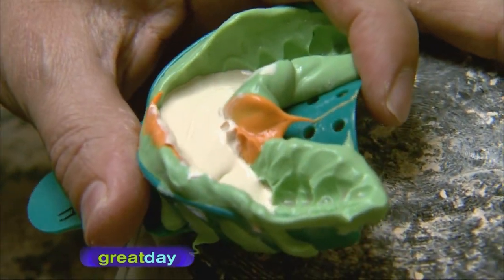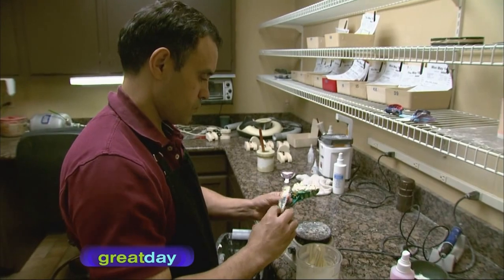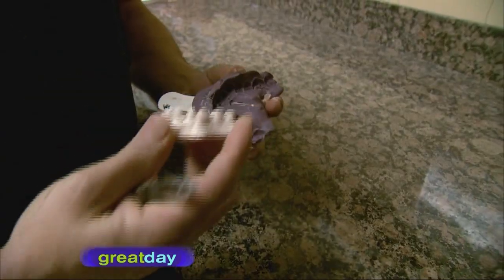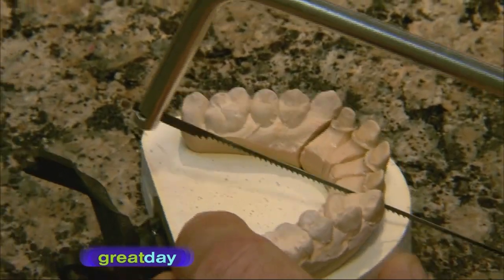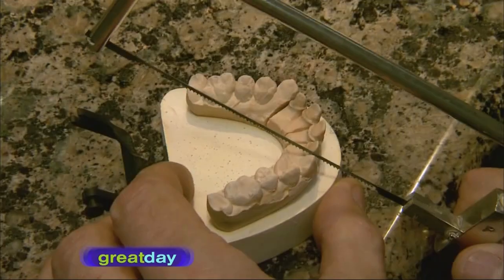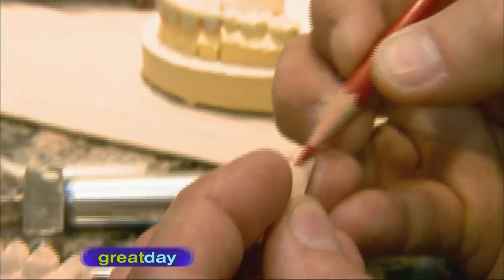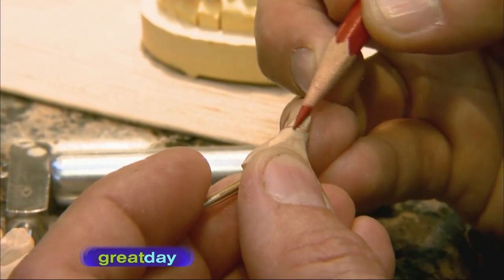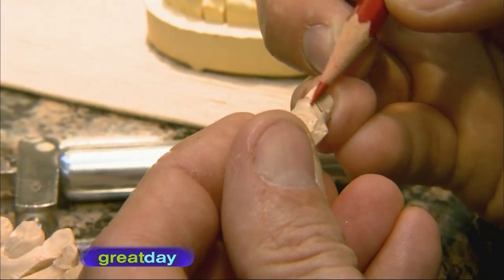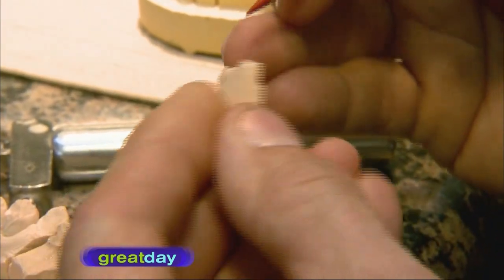The laboratory receives the case and pours up the impression using a special plaster. This is now the model of the exact tooth that the doctor prepared. The next step involves making a die — the model is sawn into three pieces with a cut on either side of where the crown is needed. The area where the crown meets the top edge of the gum is marked in red, which is incredibly important as this differentiates the great dentist from the average ones.